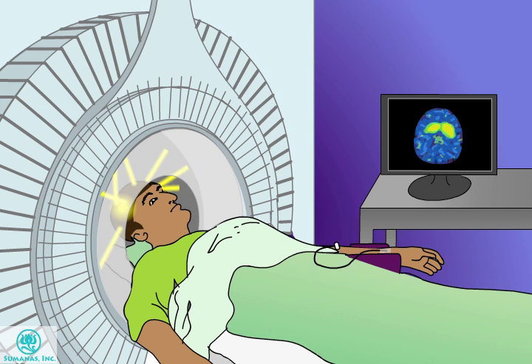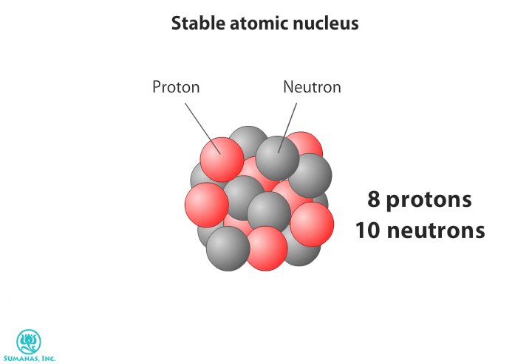Many of the radioactive isotopes used in PET are produced using a cyclotron. An accelerated stream of protons is directed at a stable target material, changing its atomic structure. To produce fluorine-18, a common positron emitter, the target material is O18-enriched water. During the bombardment, the oxygen-18 gains a proton and loses a neutron to become fluorine-18.